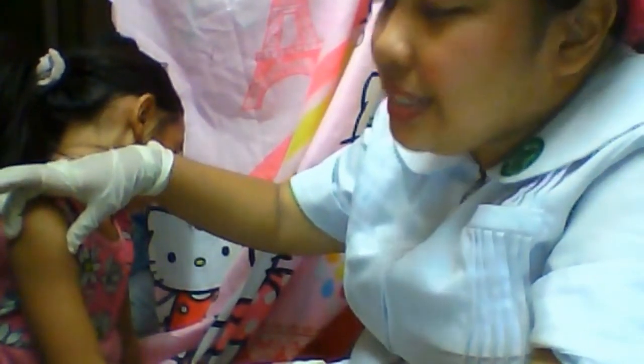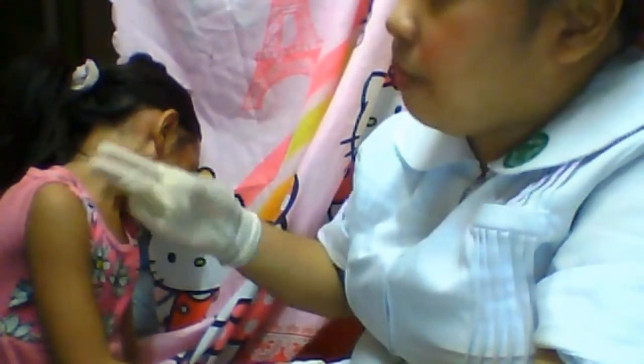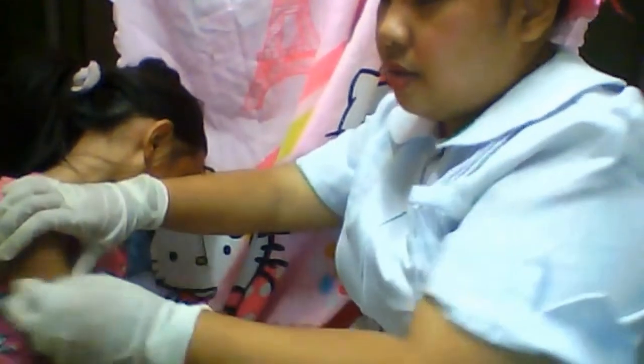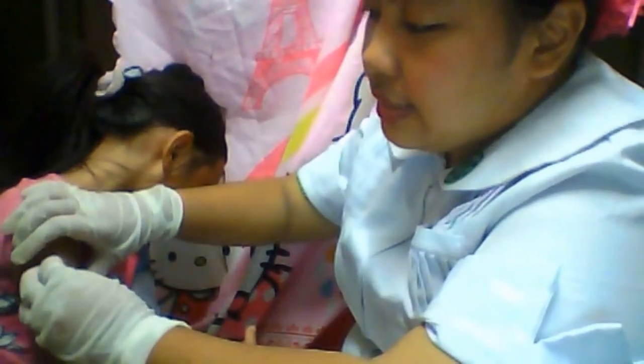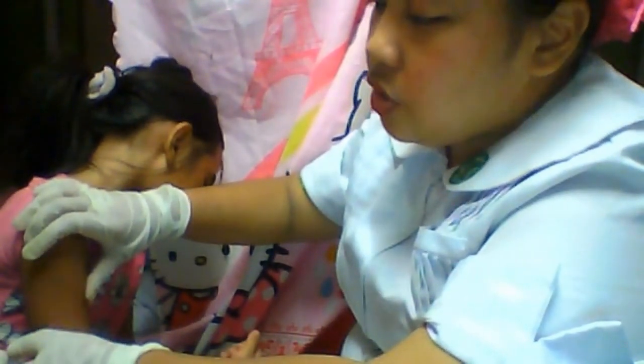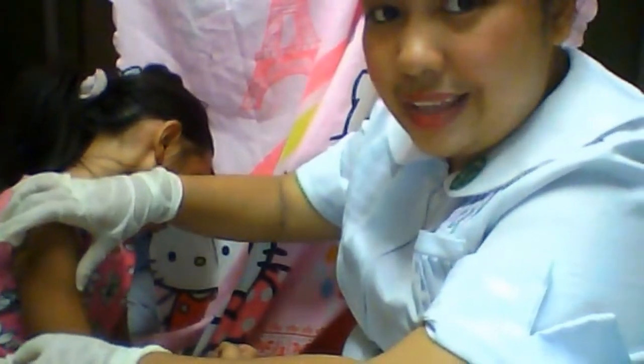So we want to hit the exact location. Again, assuming this is an adult patient, we use 3. This is our target area. So we wipe it with our wet cotton ball. What we do is a circular motion from inner to outer, one direction only, because we want to disinfect the area and at the same time avoid recontaminating the already clean area.